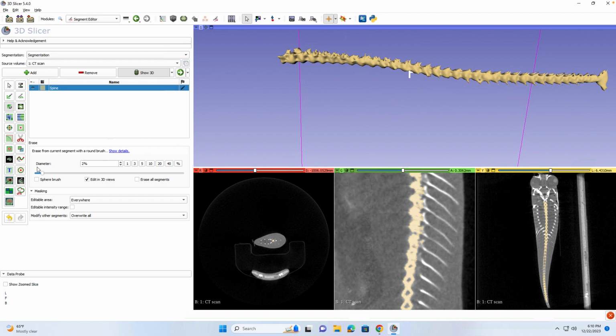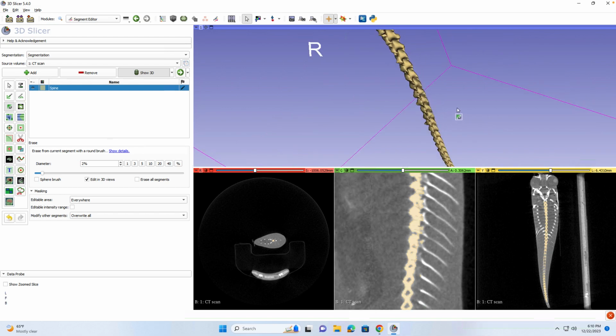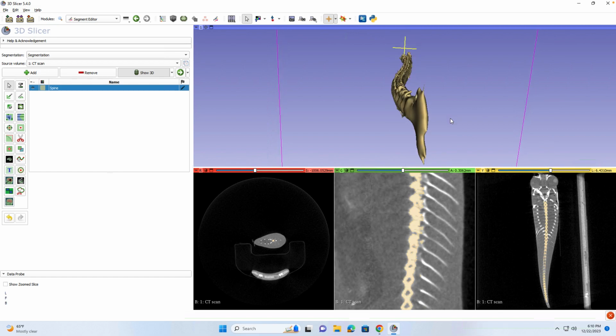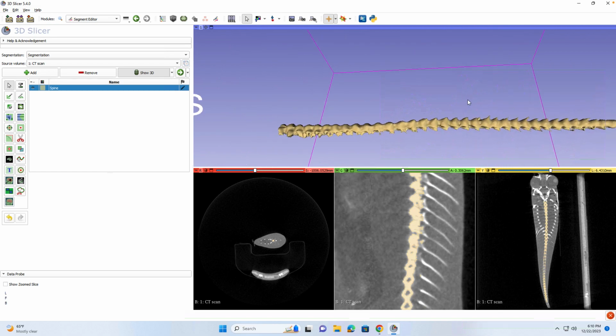After that, you can go in and, you know, I probably could have left it a little, but that was another thing, like keeping the intensities a little higher, so those connections like right there and everything stayed some more. So just be mindful of that. This is still very good looking. It shows the entire spine.